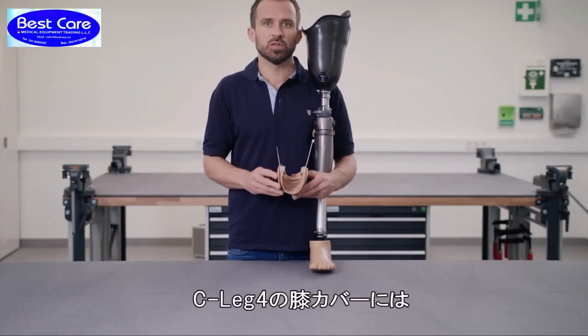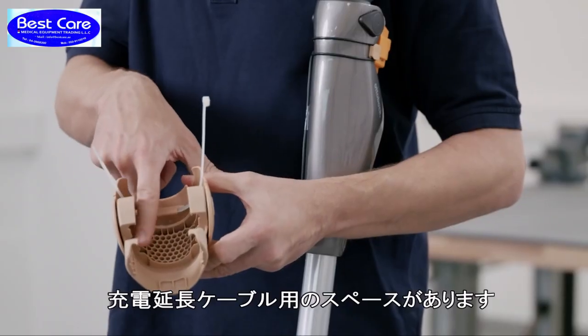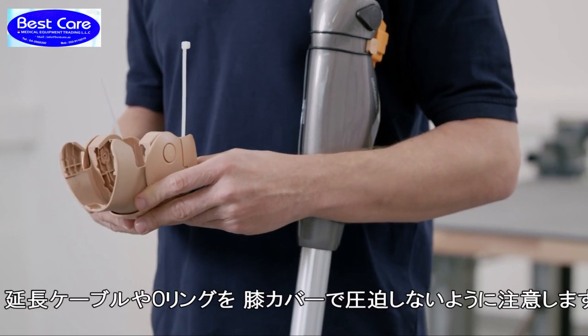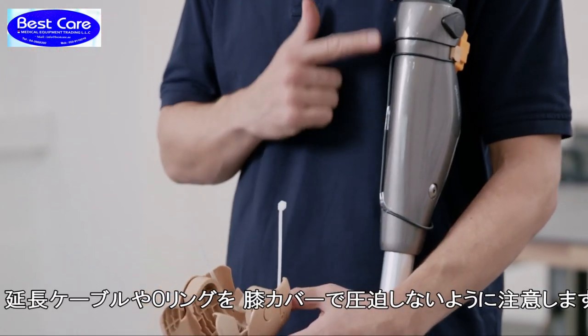There is another small difference for the C-Leg 4: the functional knee part has an opening for the proximal charging cable extension. The profiling of the knee part must not press against the cable or the O-ring.